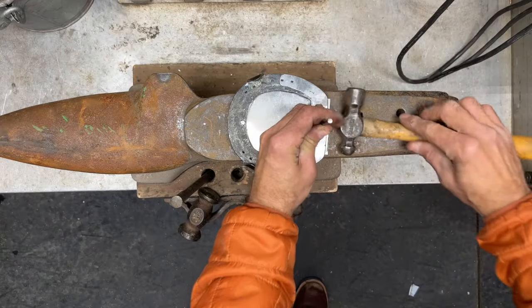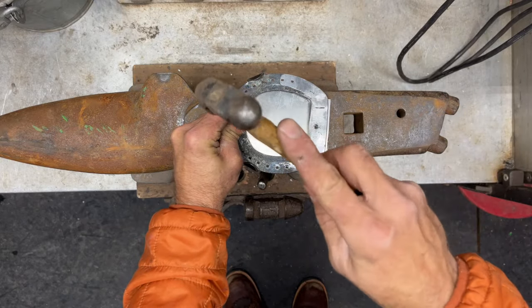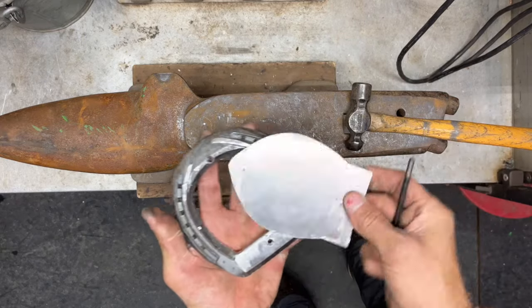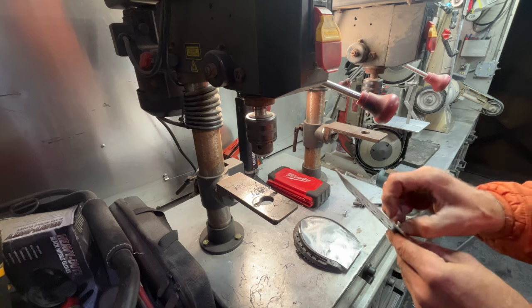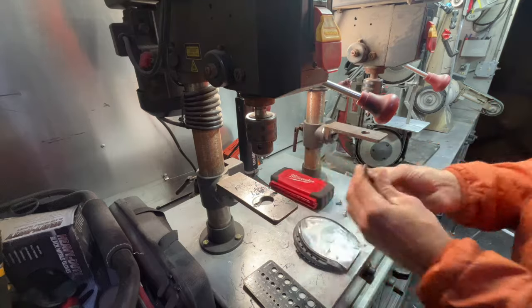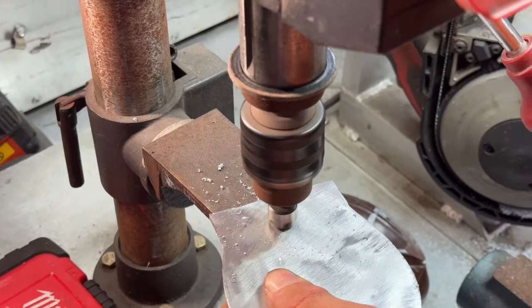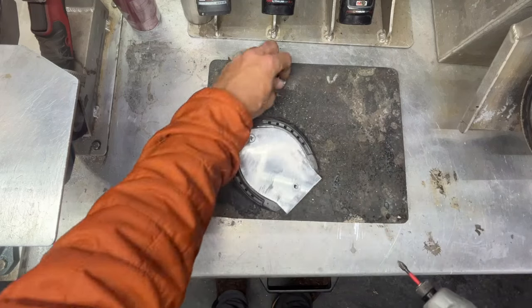I used a 13/64th center punch to mark where I need to drill the holes for my plate. Then I used a quarter inch drill bit, which was slightly larger than the screw I was going to be using to attach the plate to the shoe. Countersink the holes so that the screw can sit flush against the hospital plate.